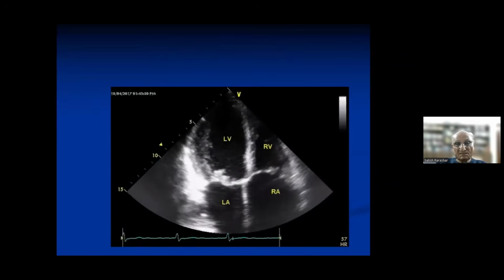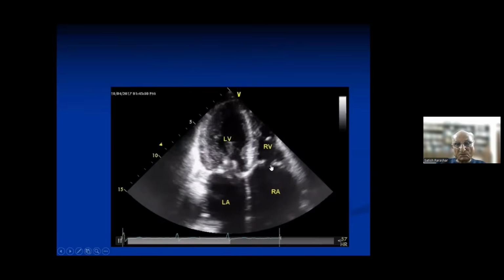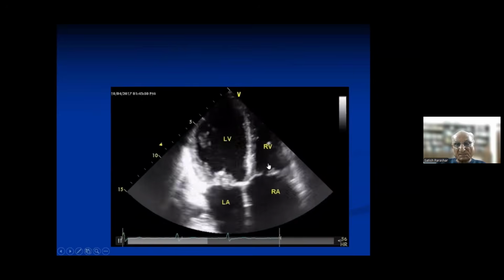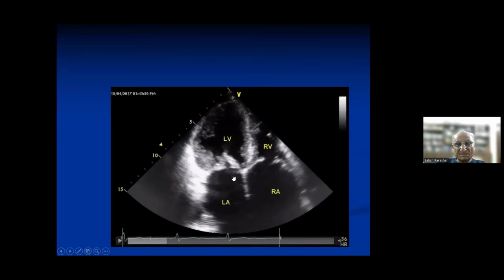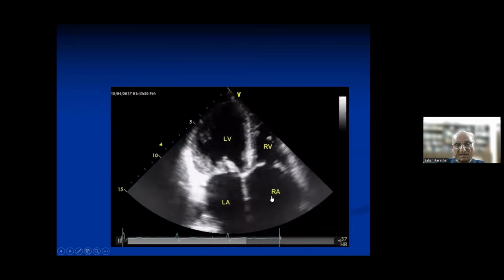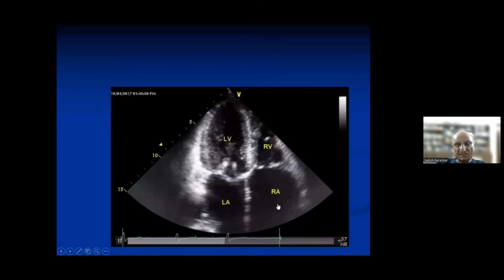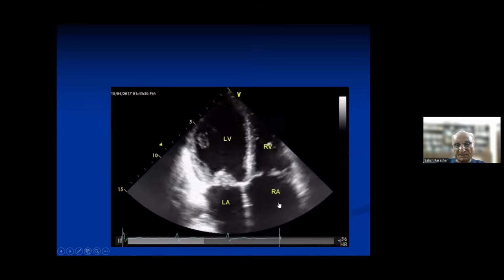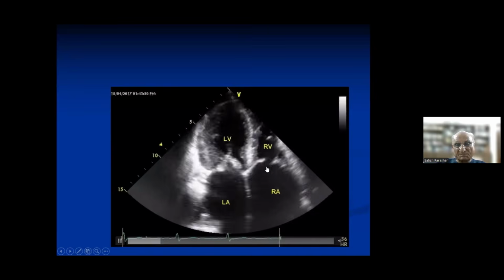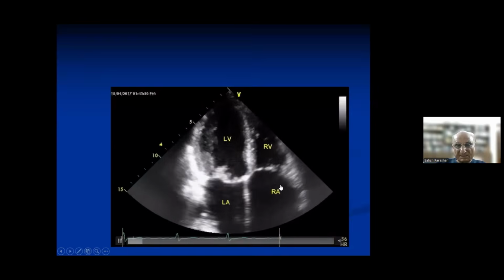Now you see a mitral stenosis and tricuspid stenosis. You see there is a restricted motion of the tricuspid valve. There is a thickening of the tricuspid valve, and there is a fairly calcific mitral stenosis. And you see both LA and RA are enlarged. Why? In the LA, because it is the feeding chamber, it is enlarged. The feeding chamber is the right atrium, pushing blood against a restricted tricuspid orifice. So their pressure increases, and because their pressure increases, the RA size increases.